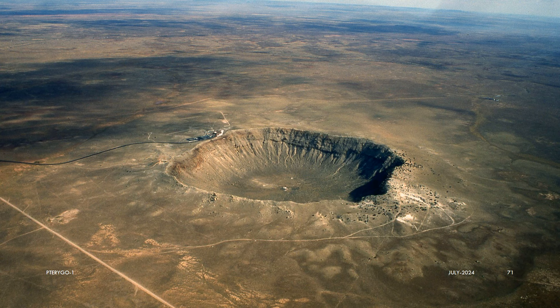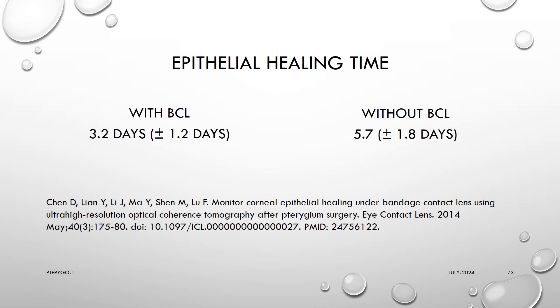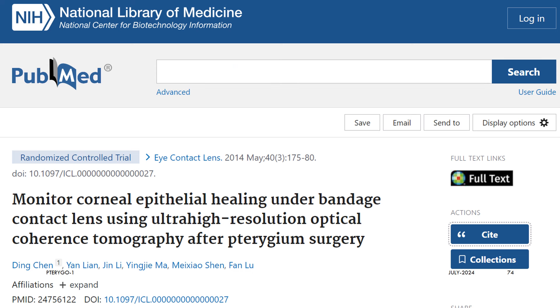We never had any case of persistent epithelial defect in any of our cases. In fact, epithelial healing is much faster in the shielded environment of Pterygo: 3.2 days with BCL versus 5.7 days without BCL. This is an interesting publication on this subject.